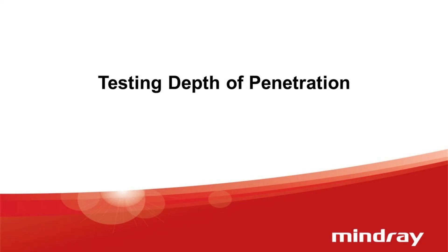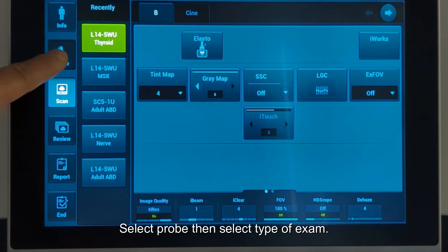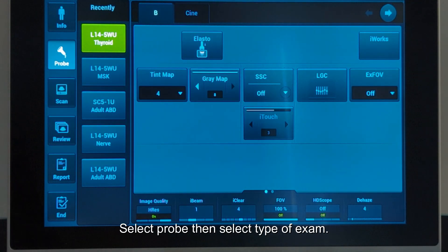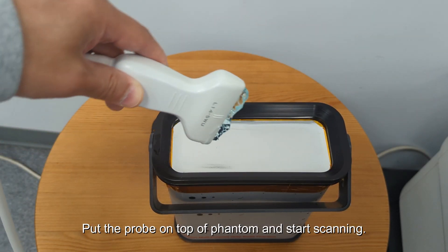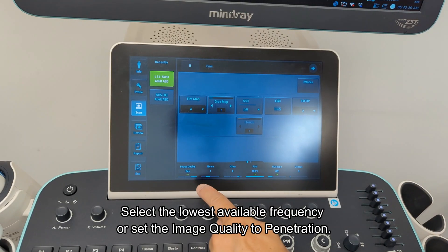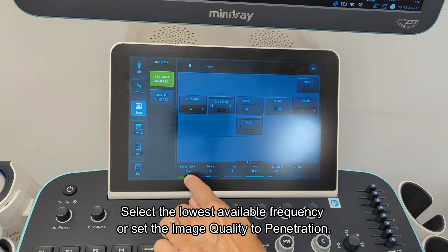Testing depth of penetration. Select the probe, then select the type of exam. Put the probe on top of the phantom and start scanning. Select the lowest available frequency or set the image quality to penetration.